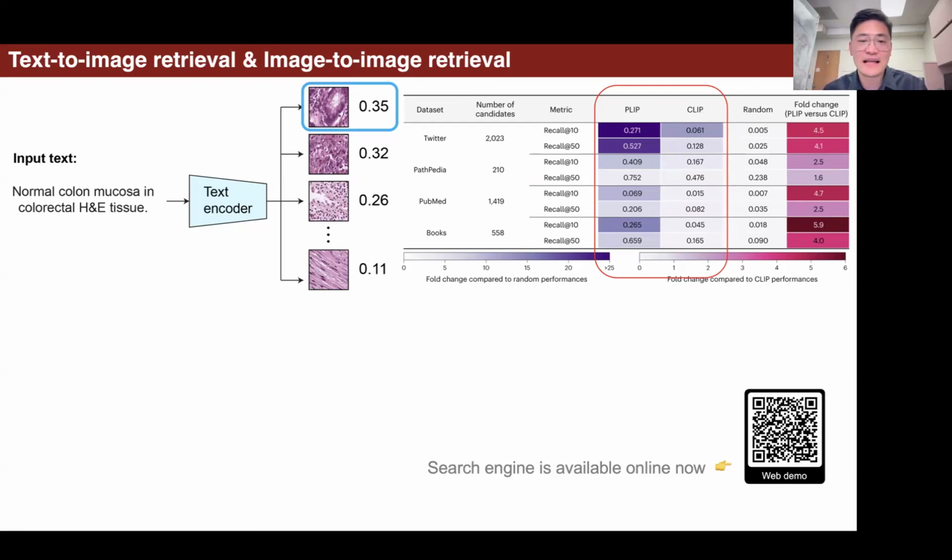So really, retrieval is based on how well the dataset is established and how many different rare or difficult cases are included in it. And in the future, we anticipate we can make further improvements to image retrieval by expanding our knowledge set and also improving the vision encoder as well.